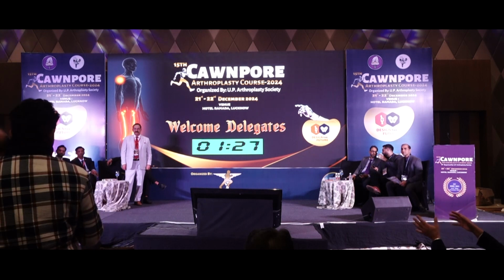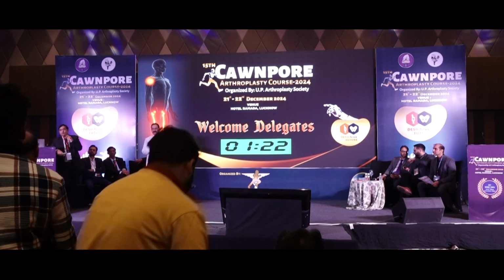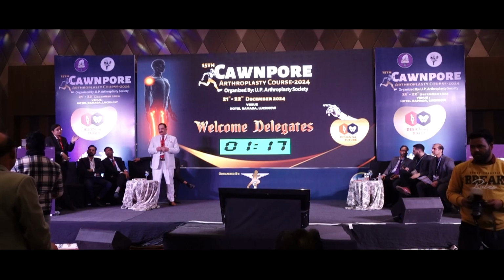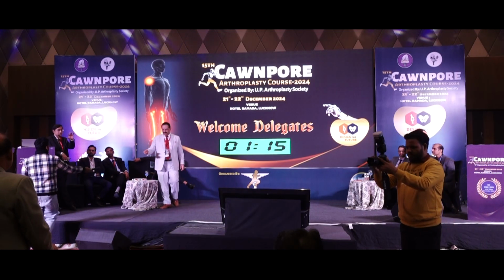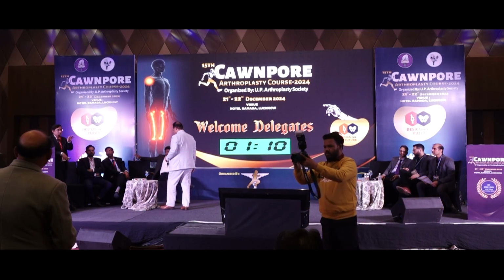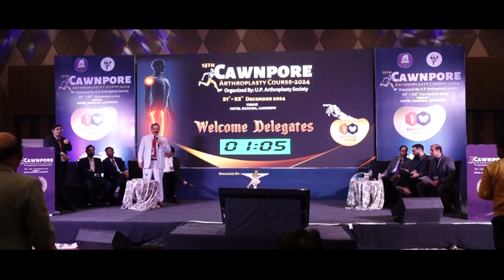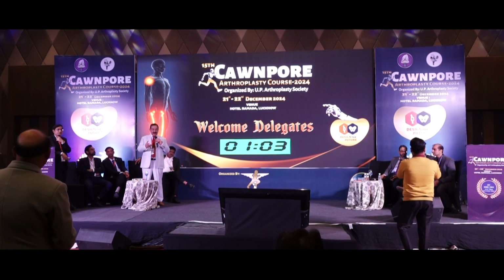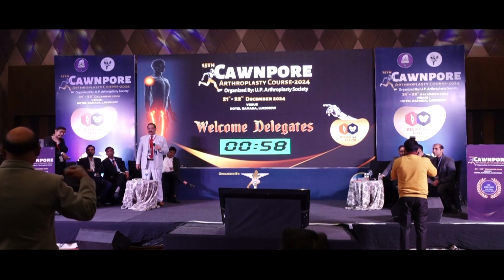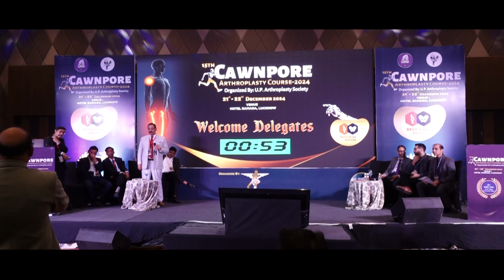With the trabecular metal, that is a problem. It has been seen that there is heterotopic ossification over the tantalum; it throws a lot of bone. That is why we always put cement over the surface of the augment. It is very aggressive. So to cover the defect, use the metal cage, or bone taken from the iliac crest, or if it's both sides, taking it from the head.